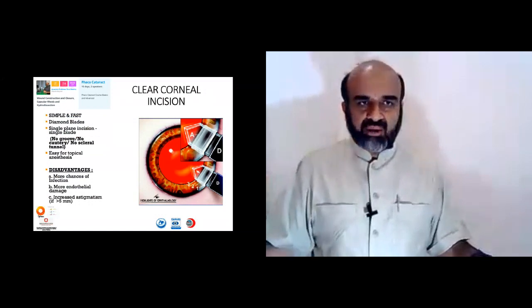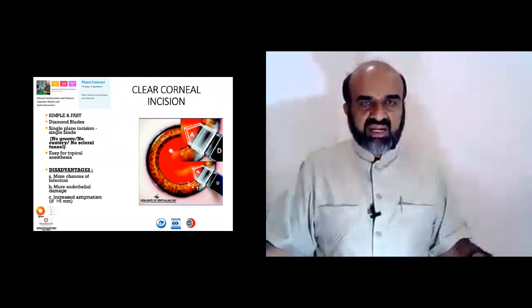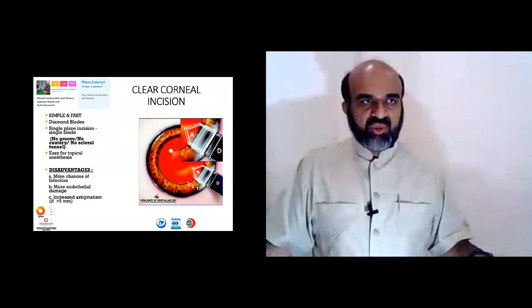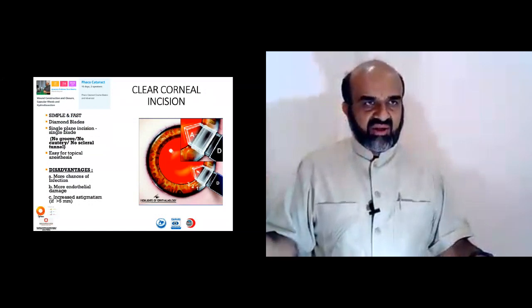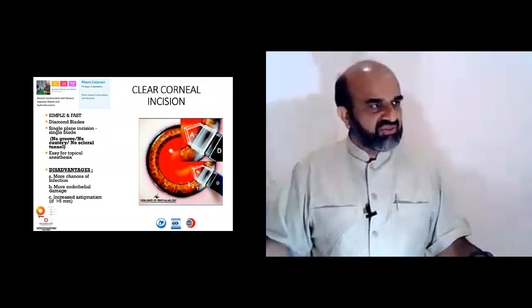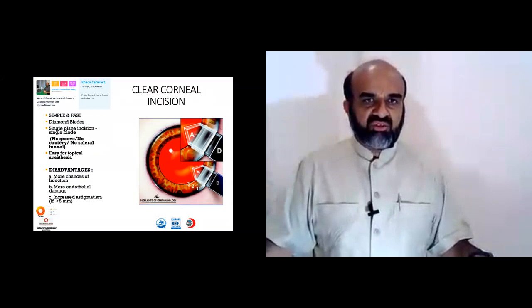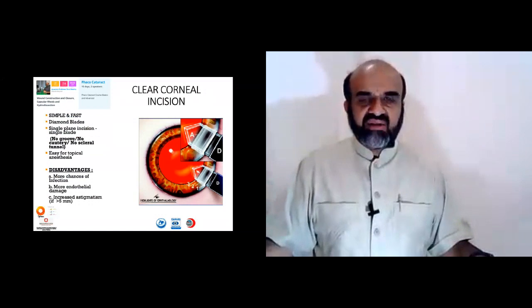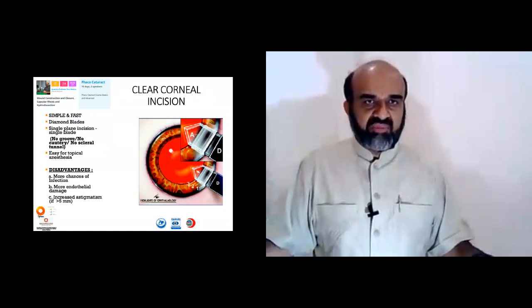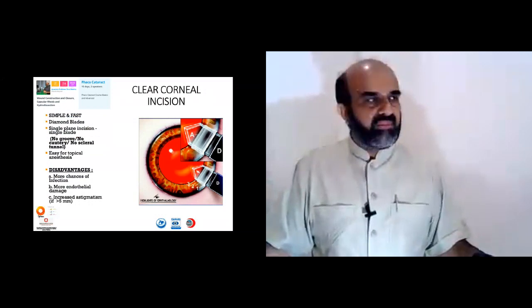So even if you are in favor of clear corneal incisions, you will see in later slides that the recommendation is to place it as far peripheral as possible, so that there are a little spots and twigs of bleeding from limbal capillaries once you are placing the incision. That is very helpful. That leakage of blood and that little cutting of limbal vasculature is going to impart very good, quick and strong healing response from the limbal area.